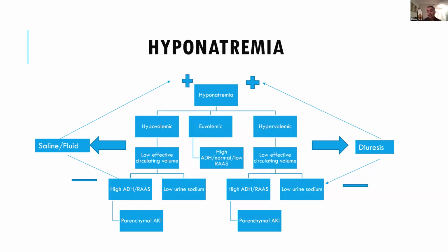And whenever I have a hyponatremic patient where I suspect that there may be a cardiorenal syndrome physiology, I'll put an ultrasound probe on them. Now, the caveat to this is that you need to learn when you pick up the probe, and you're looking to figure out if there's something more complex or not. If I have a history of someone coming in with cholera, right? They're throwing up and they have profuse diarrhea, I'm not ultrasounding them. The pretest probability of reduced intravascular volume is so high. There's no point. I know this patient is on the left side here, hypovolemic hyponatremia. I don't need to do an ultrasound.